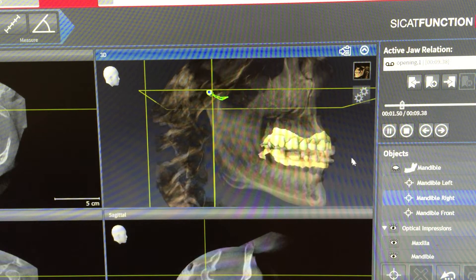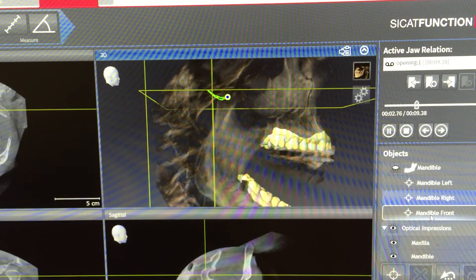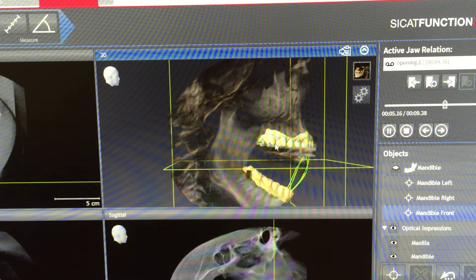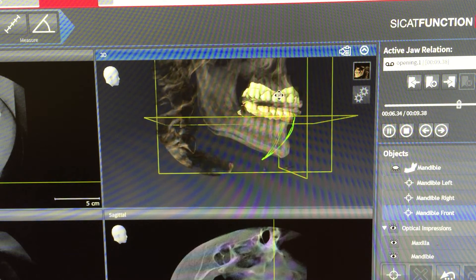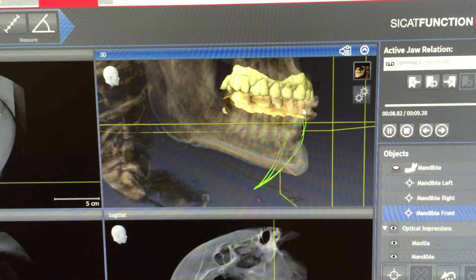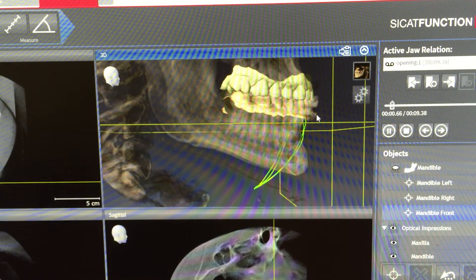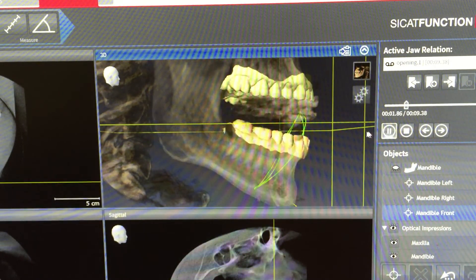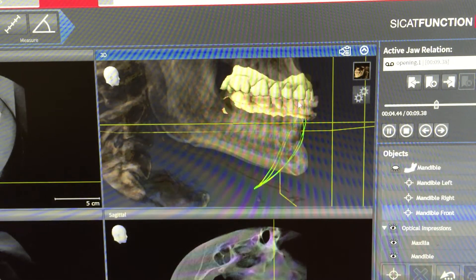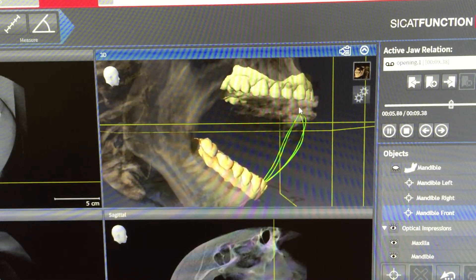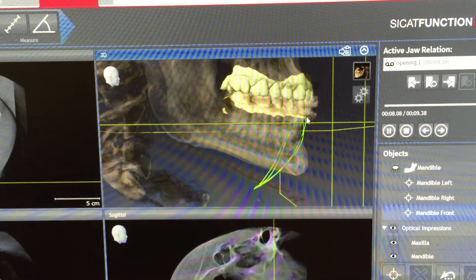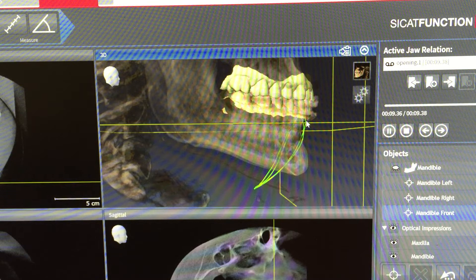In this particular case, we can see the graphic in the front and visualize what happens when this patient tries to open the mandible. The patient is forced by the occlusion, so the patient goes back and closes toward the back part. But as the patient wants to open further, he wants to release the compression happening in the joint and creates a step in this anterior part.